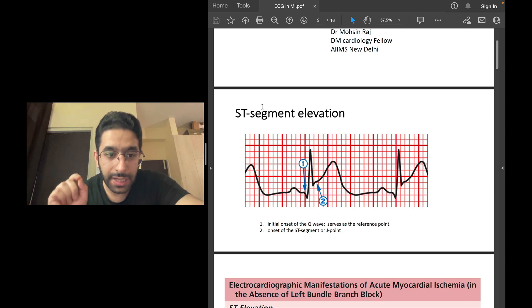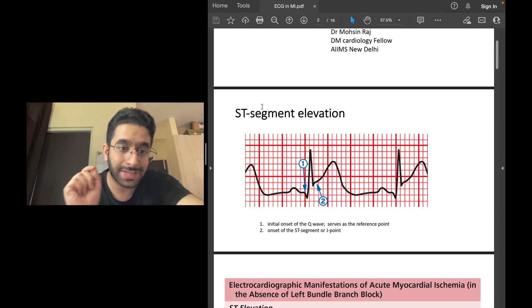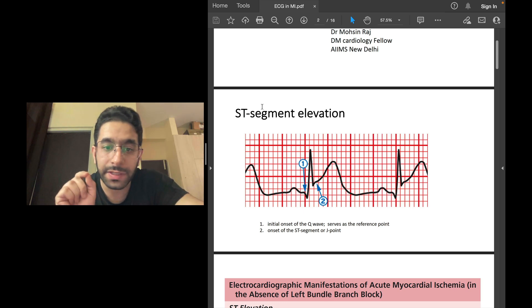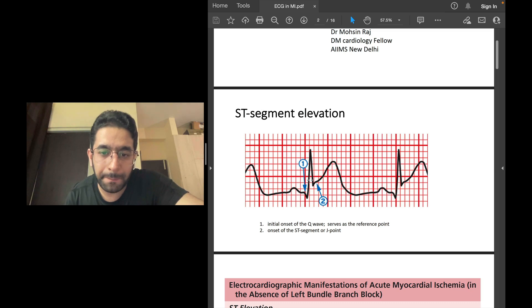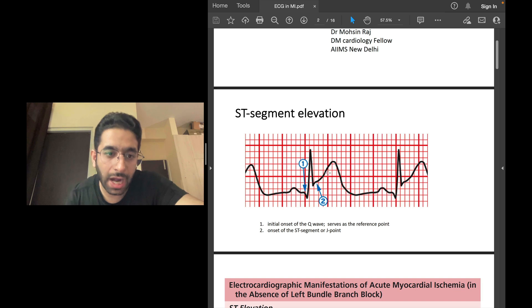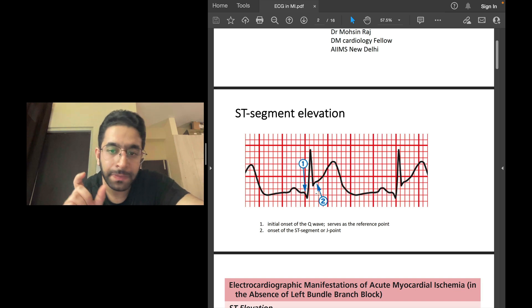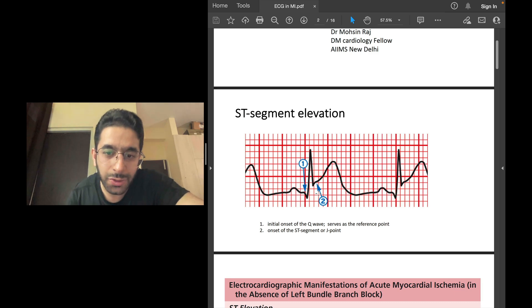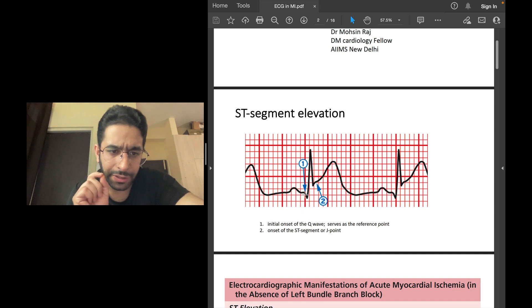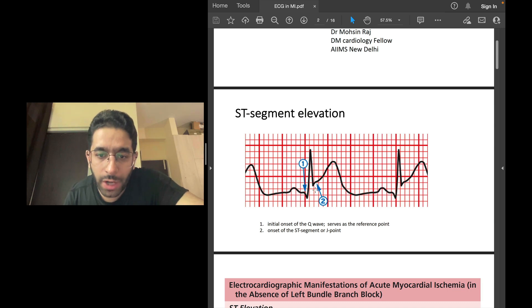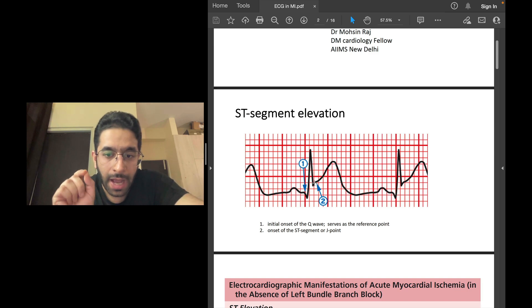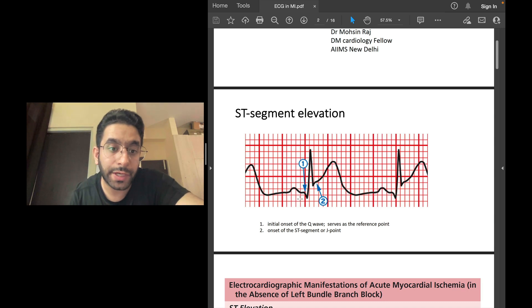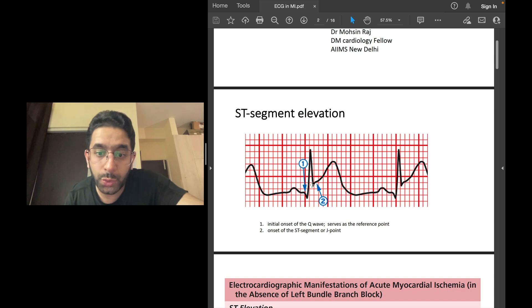How do you detect ST segment elevation? The ST segment is the part between the end of the QRS complex and the start of the T wave. To detect ST elevation, consider two points: point one is the onset of the Q wave, which is your reference point, and point two is the onset of the ST segment, also known as the J point. How elevated is point two with respect to point one — that is ST segment elevation.